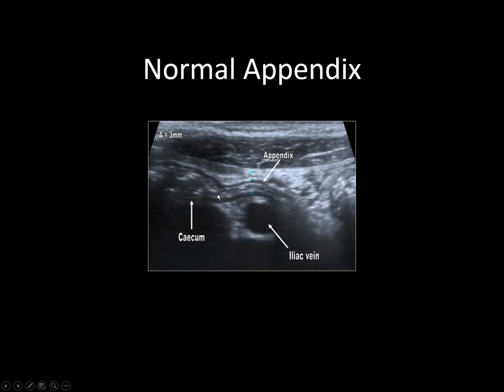You have to see it all the way, ideally from the base to the tip, because there is such a thing as tip appendicitis. It will be compressible. The surrounding fat won't be indurated and abnormally hyperechoic. This image, I think, has a high gain, but you can generally use the subcutaneous fat as your internal control as to whether the periappendiceal fat or the mesoappendix is hyperechoic.